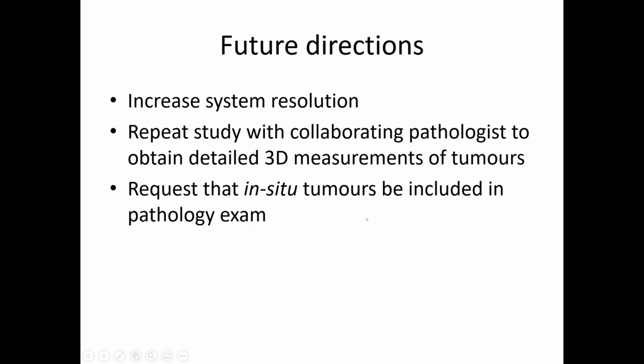investigations. So in the future, to combat these issues, we plan on increasing the system resolution by augmenting our array with some higher frequency transducers. And we plan on approaching a pathologist that we can collaborate with in order to obtain detailed 3D measurements of both the invasive as well as the ductal carcinoma in situ components of these tumors.